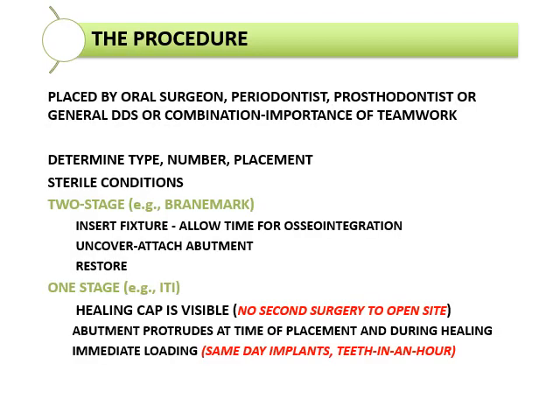Just know that there are two types of implant placements, a two-stage, which is also known as the Branemark procedure, which is named after the doctor. And this stage is successful. Healing time is about 3 to 6 months.